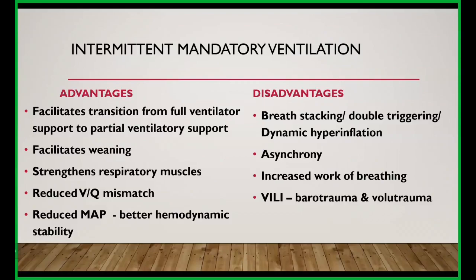Disadvantages, as I said, there will be superimposition of the spontaneous breaths over the mandatory breaths, which can result in breath stacking and double triggering, which can lead to dynamic hyperinflation or auto-PEEP. Asynchrony is one more complication, but this can be met by synchronizing in your SIMV mode. Due to asynchrony, there will be increased work of breathing, and increased work of breathing will naturally lead to ventilator-induced lung injury, barotrauma, and volutrauma.